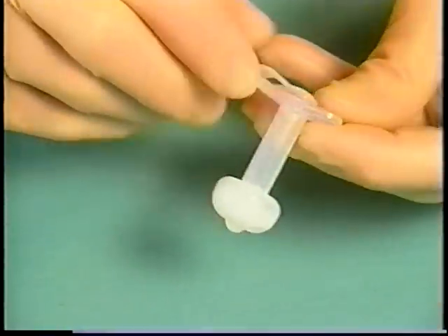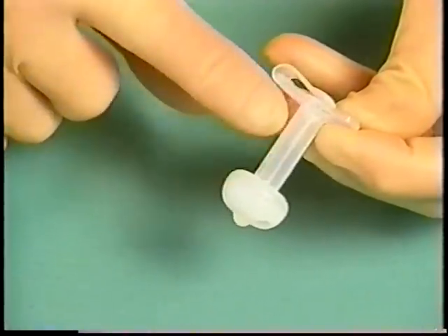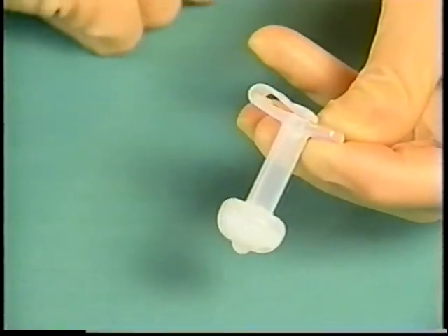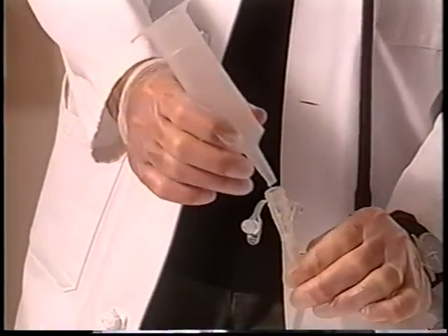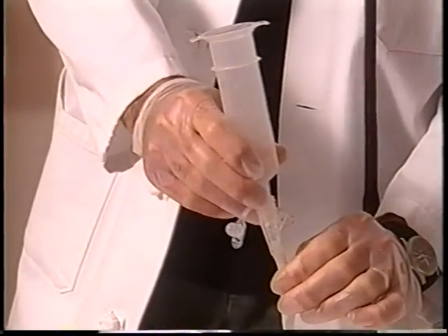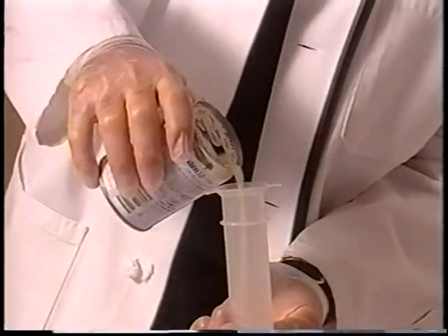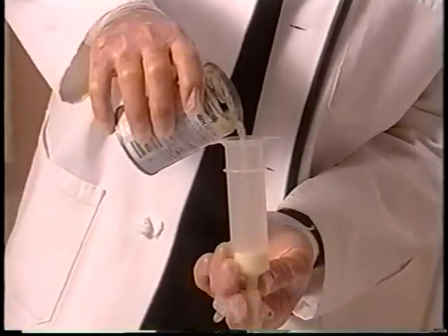The low profile device chosen must be long enough to allow positioning of the internal and external bolster without creating tension on the tract. The original PEG tube design makes the feeding process easier for nurses and caregivers as it allows more of the tube to be grasped, making syringe or feeding tube attachment easier.